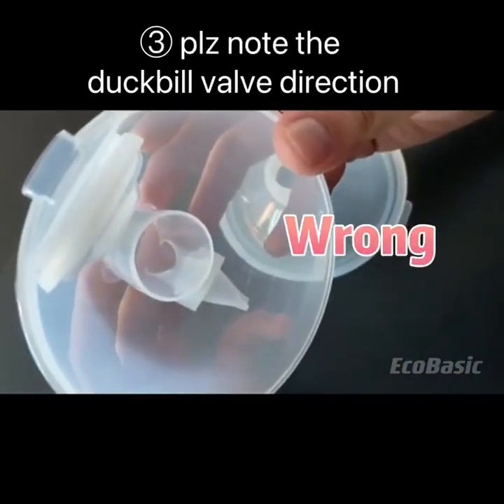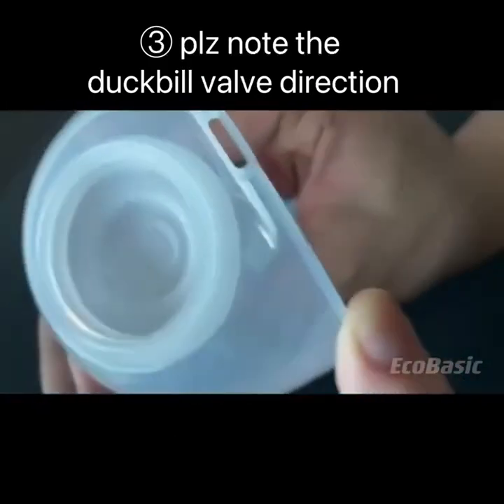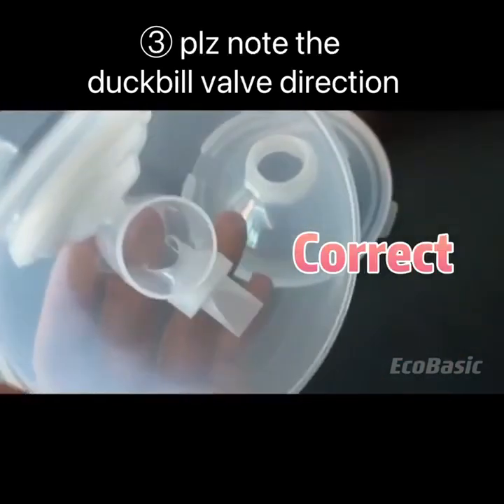Last, please note the duckbill valve direction. Wrong direction. Correct direction.